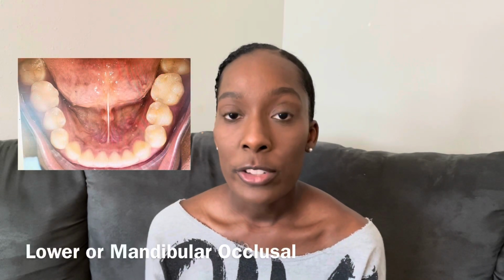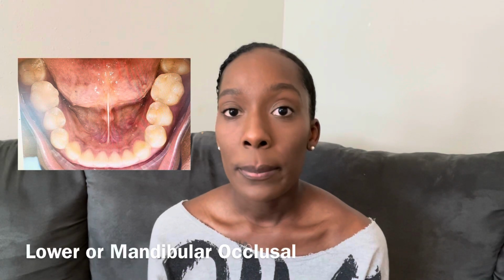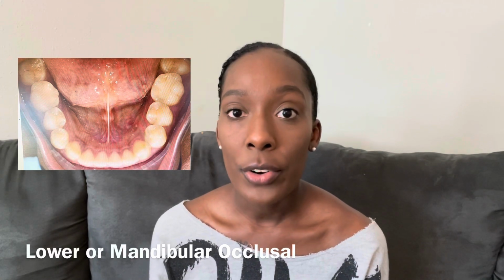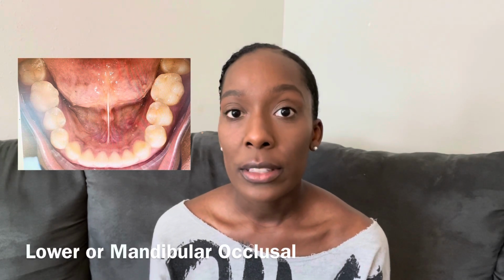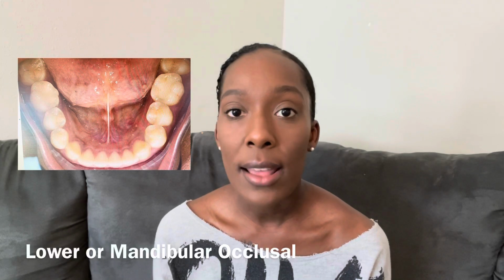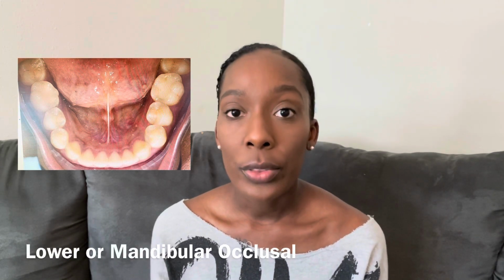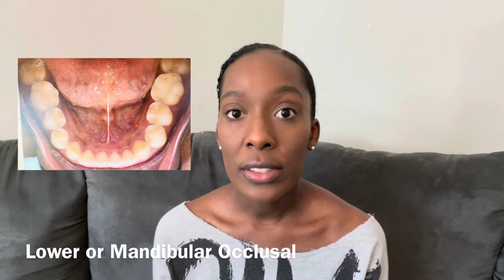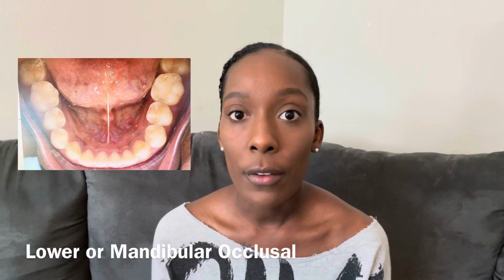The next intraoral is the lower teeth, and you also may see this titled as the mandibular occlusal because the lower teeth are known as the mandibular. And the surfaces of the lower teeth are called the occlusal. So you will see it paired as mandibular occlusal. And in this image, the orthodontist is looking at the lower teeth and seeing how they are aligned and also the surfaces of the lower teeth.